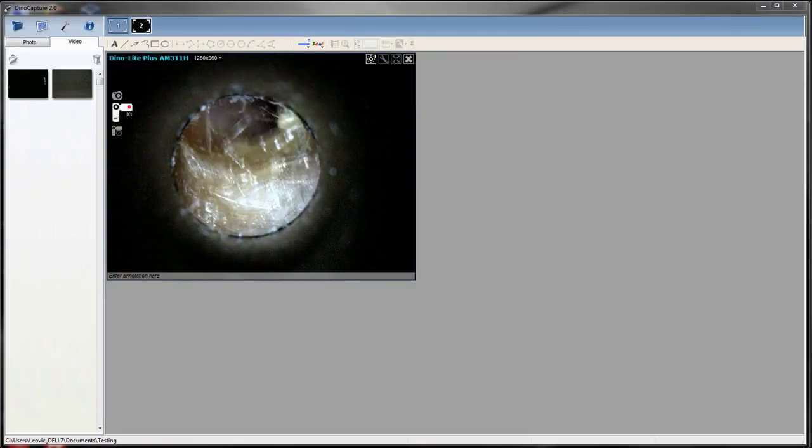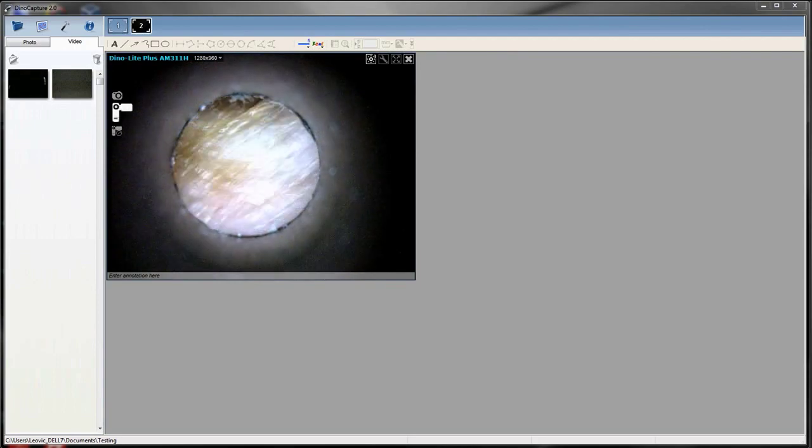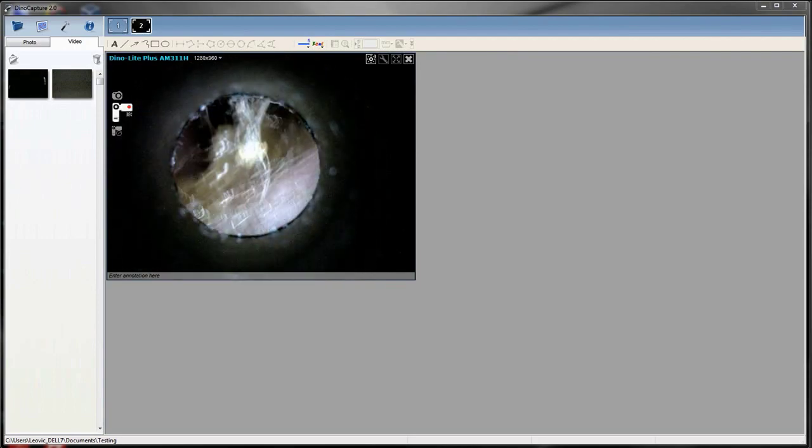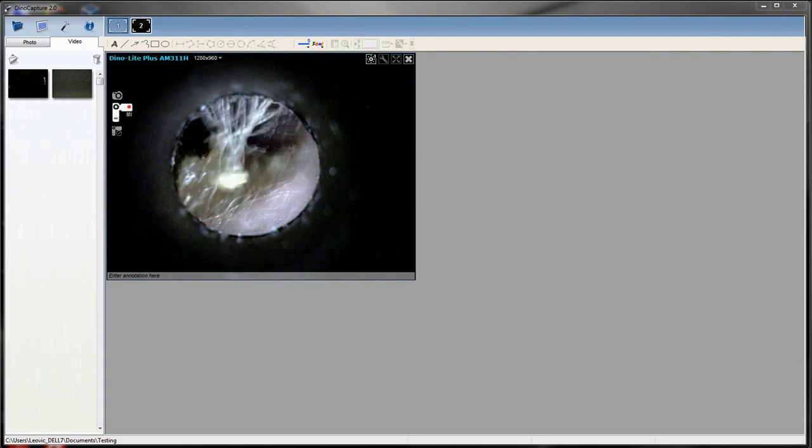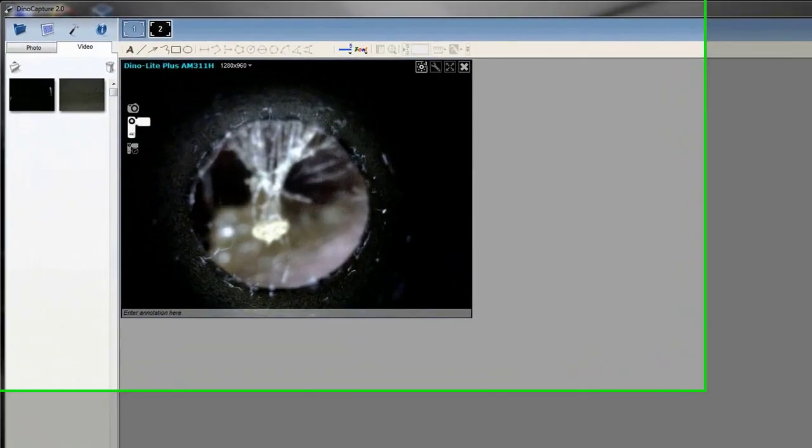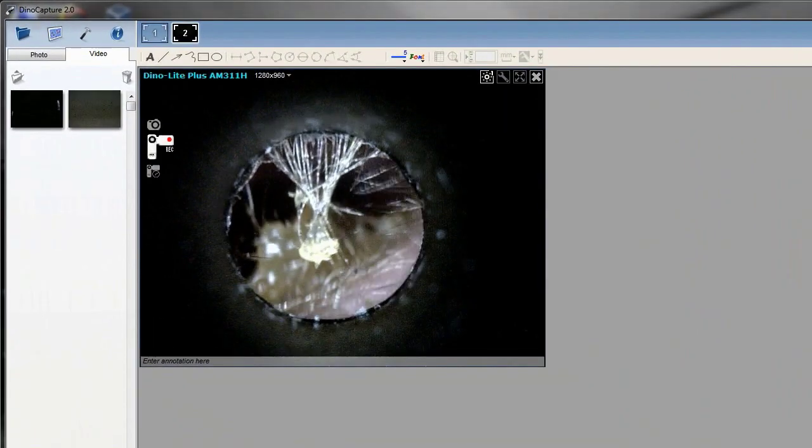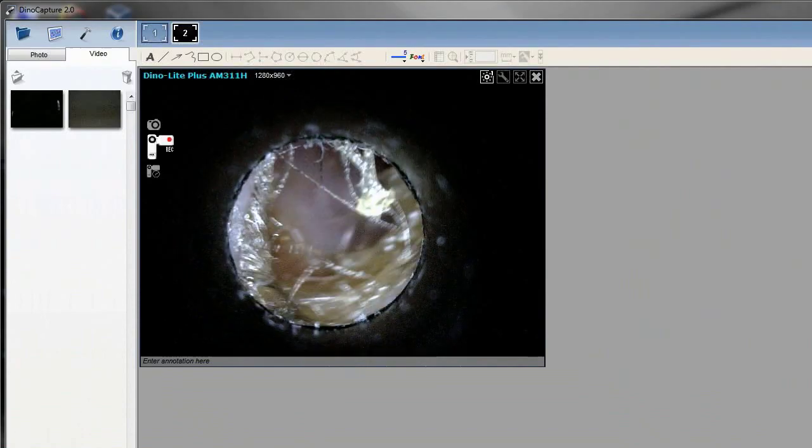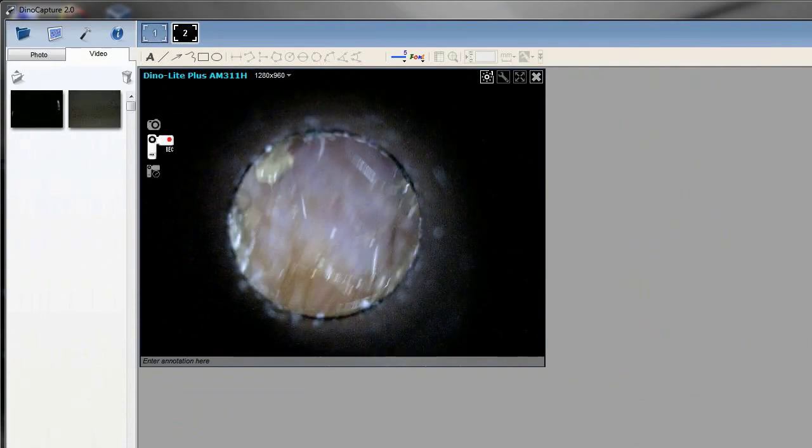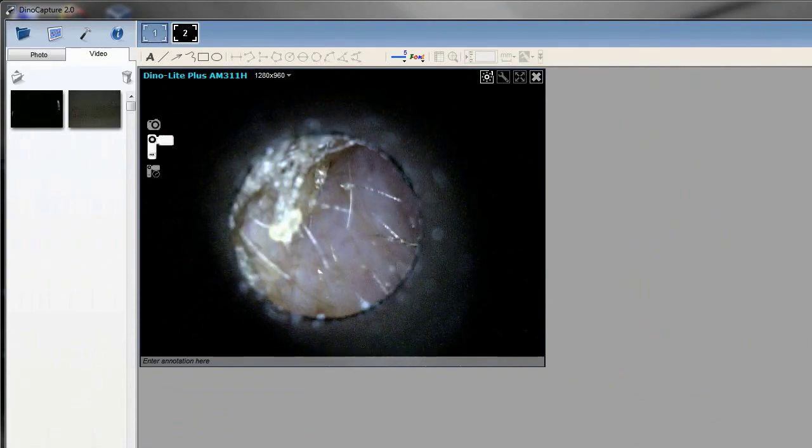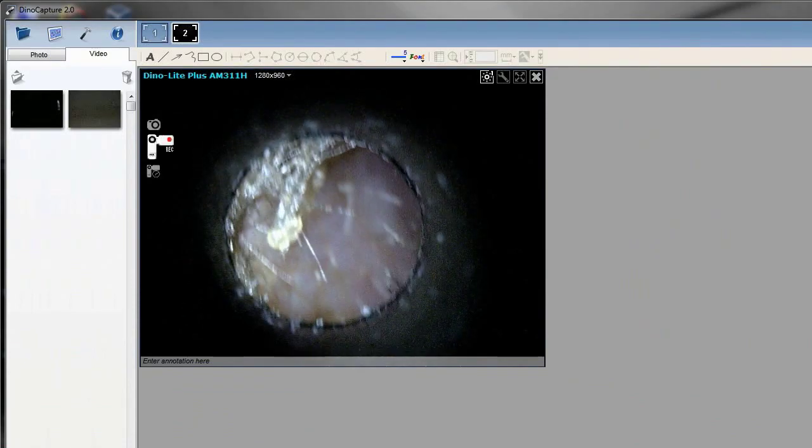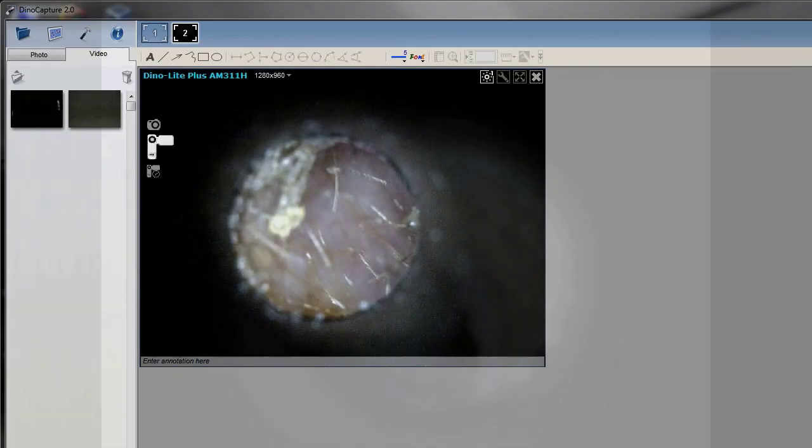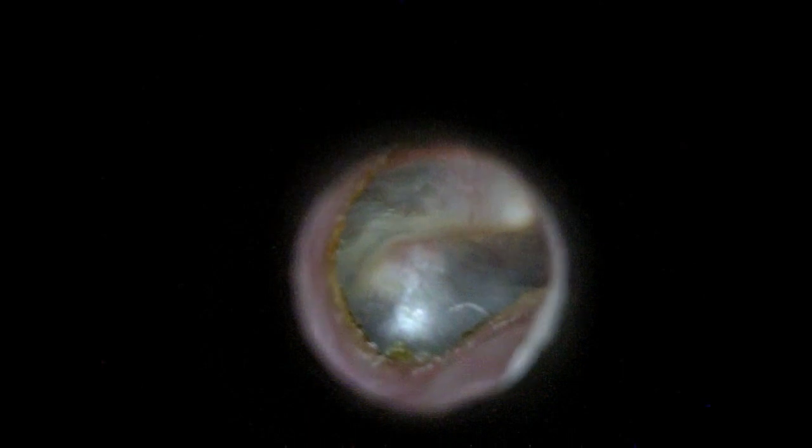With our DynoCapture software you are able to take pictures, videos, as well as time lapse videos. Here is a sample of a video that we have previously taken. True full screen view is also available and this is the same with all of our models.